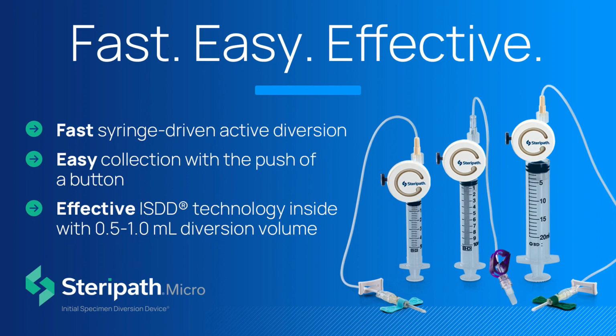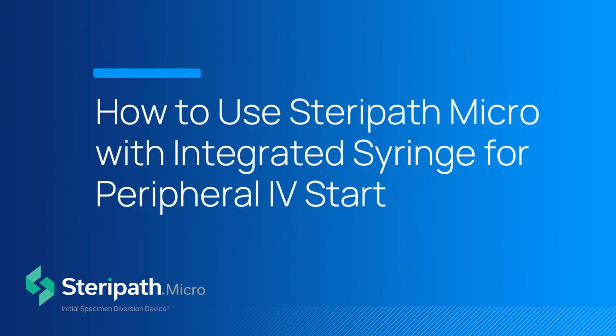The Steripath micro blood culture collection system reduces false positive blood cultures by diverting and sequestering the initial 0.5 to 1.0 milliliter of blood, preventing skin contaminants, when present, from entering blood culture bottles. The following video tutorial demonstrates proper use of Steripath Micro with integrated syringe used for peripheral IV start.